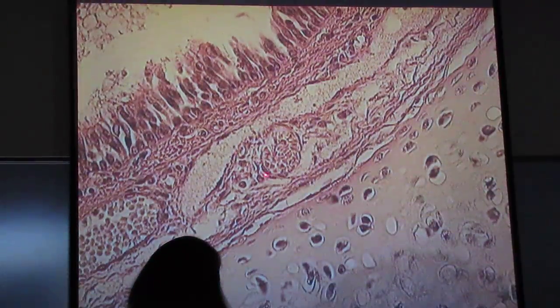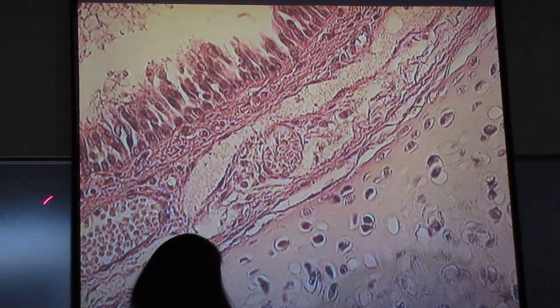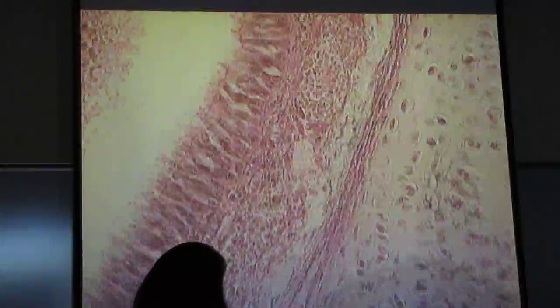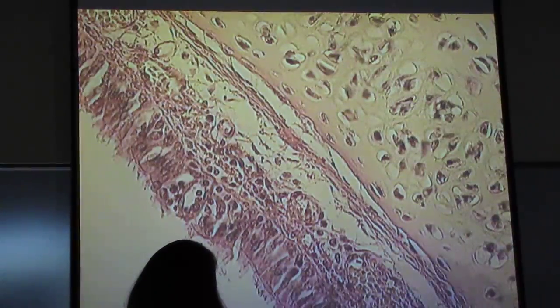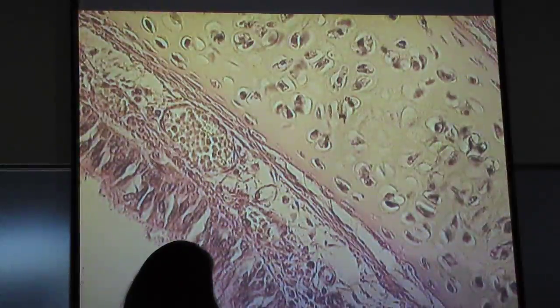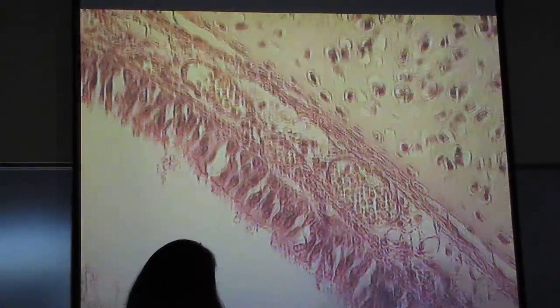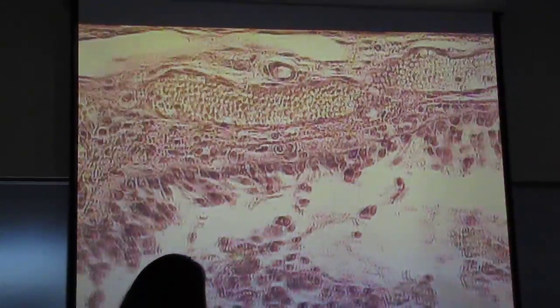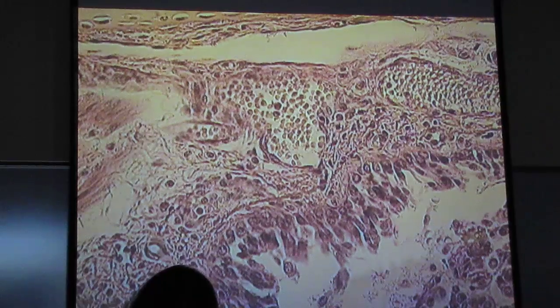In this area, these are not the best. These are blood vessels. These are blood vessels. This slide doesn't have the nicest. There's a little vein going around. Yeah, this one doesn't have the best seromucous glands for sure in this area. But let's put one that does.